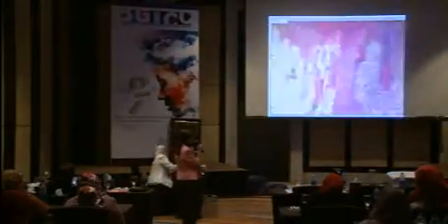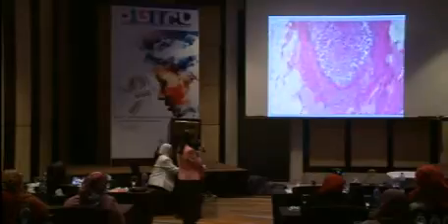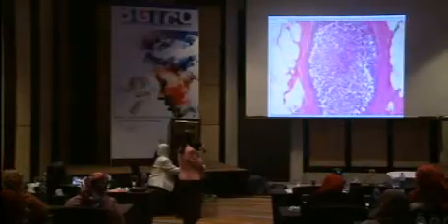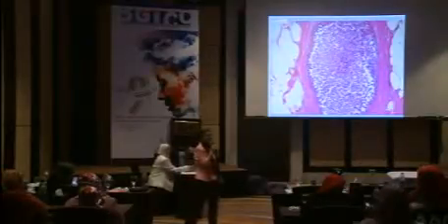With, we go to the high magnification. It's a solid growth pattern, and when you look at the individual cells, it is in the same category that we were discussing before, these cohesive cells, and what's our differential diagnosis here?